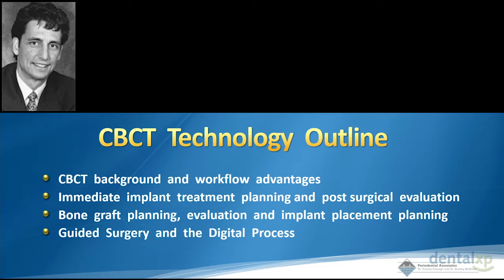Two-dimensional radiographs can look fantastic. You look at the 3D image and your results could be pretty mediocre. And so different bone graft materials need to be evaluated in your hands, and you need a nice little regime that you use on a day-to-day basis that can give you predictable results. Finally, at the end, we're going to talk briefly about guided surgery and the digital process. I just want to share a little bit of what we're doing with in-office printers to make our own surgical guides. It's been kind of exciting, a little area that we've been working with.